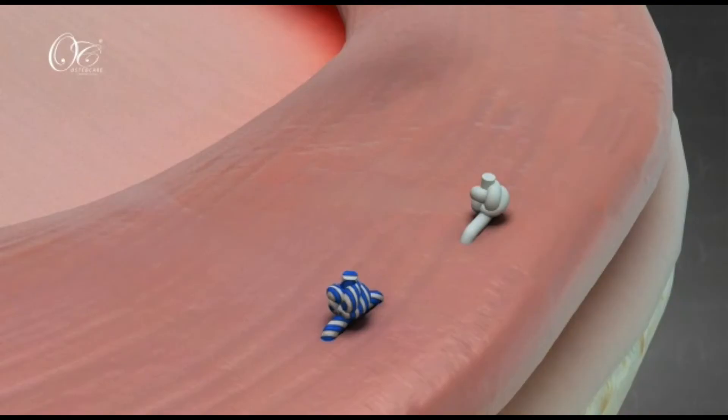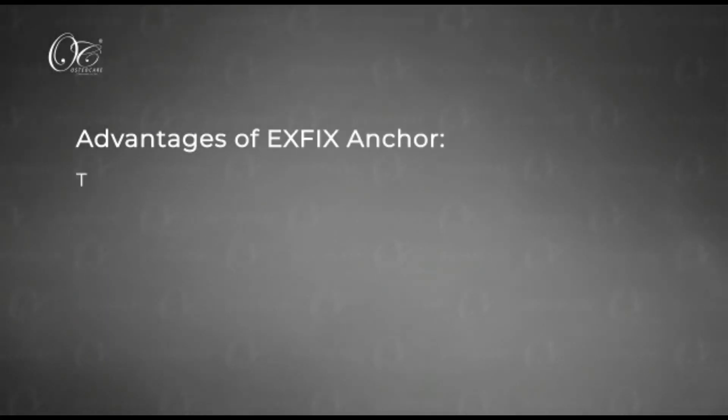Once we are done, the meniscus is reduced on the tibia, thereby reducing the extrusion.